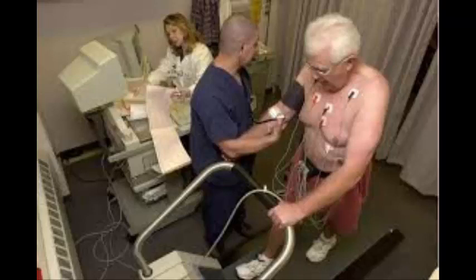High-risk findings on stress test are: low threshold for ischemia, that is within stage 1 or 2 of the Bruce protocol. Fall in BP on exercise. Widespread, marked or prolonged ischemic ECG changes. Exercise-induced arrhythmia. False negative results can occur in patients with coronary artery disease, and some patients with a positive test will not have coronary disease, called false positive.